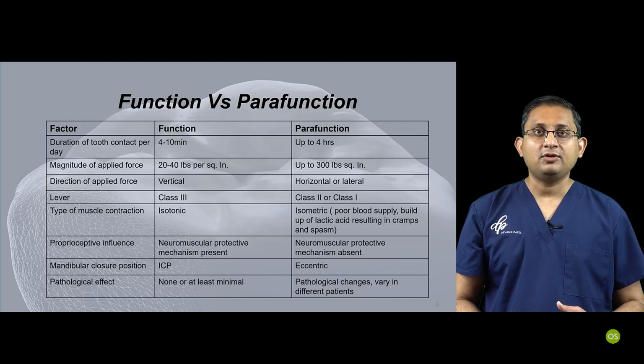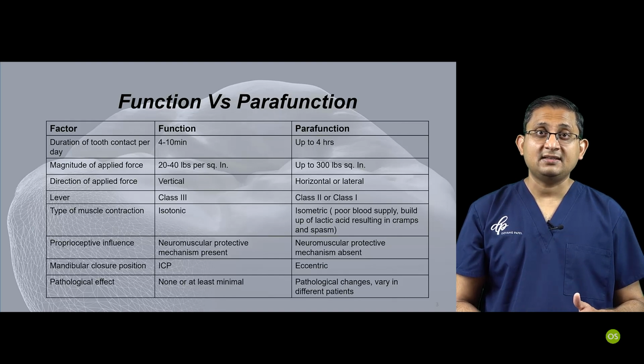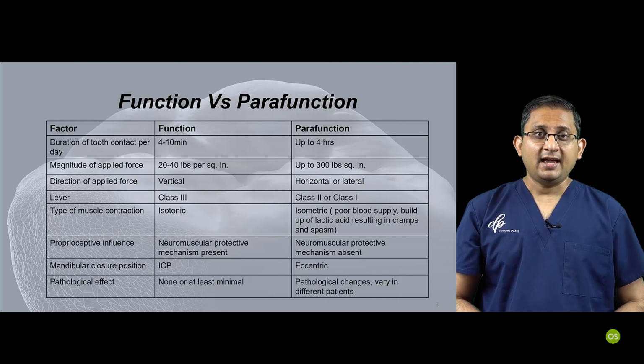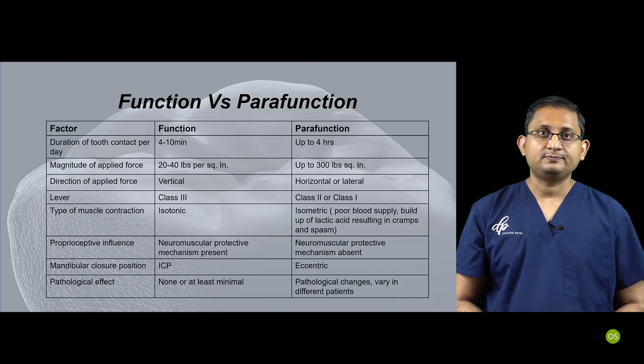So you really need to look out for those facets and see how the jaw moves, to get a better understanding of how the patient may brux or grind their teeth during the nighttime or the daytime. And obviously you have a more pathological effect because of that.